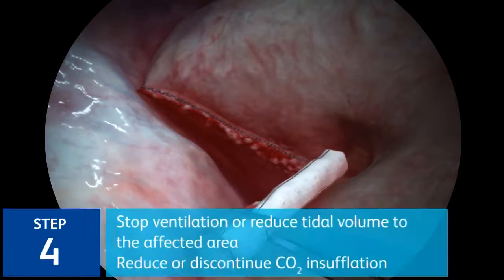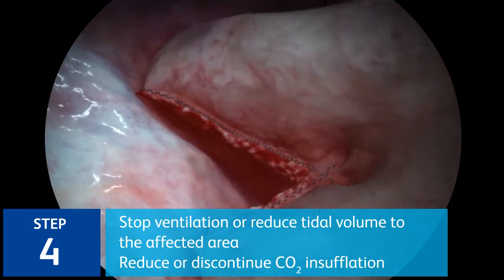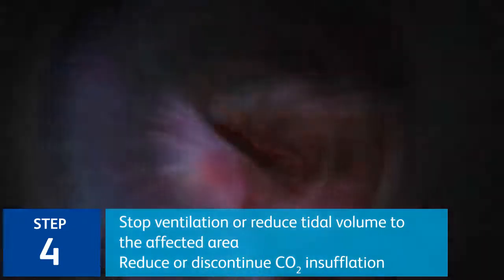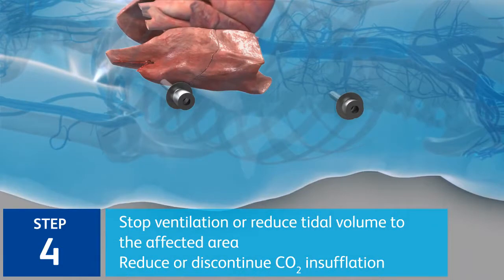Step 4. Ventilation to the affected area should be stopped. If ventilation needs to be maintained, reducing the tidal volume is recommended to minimize air leakage and lung movement during application of the sealant. In procedures where CO2 insufflation is being used, consider reducing or discontinuing CO2 pressure during Progel application and for the duration of sealant set time.